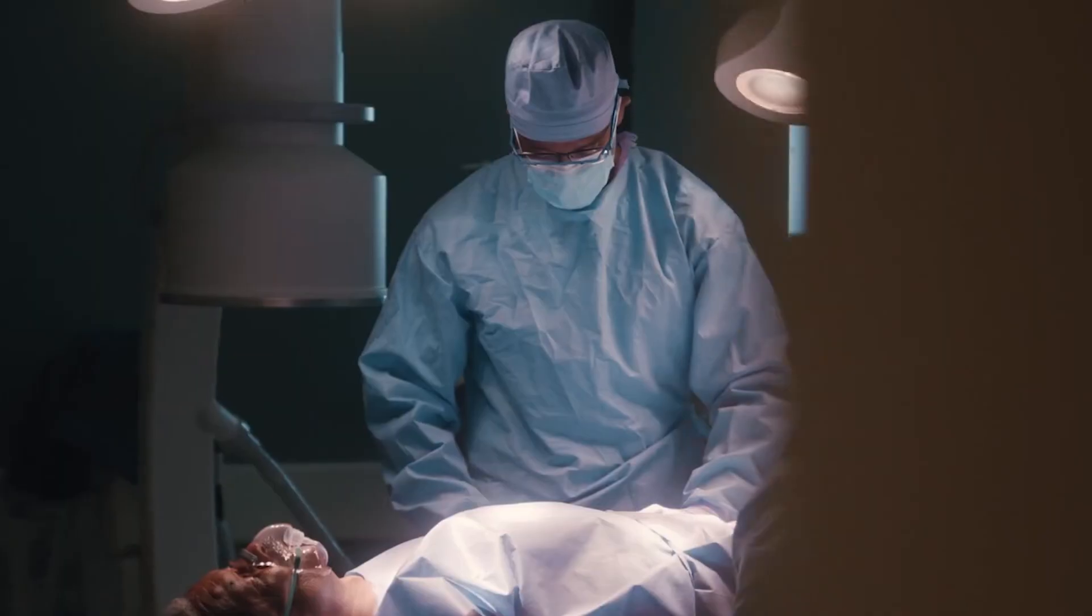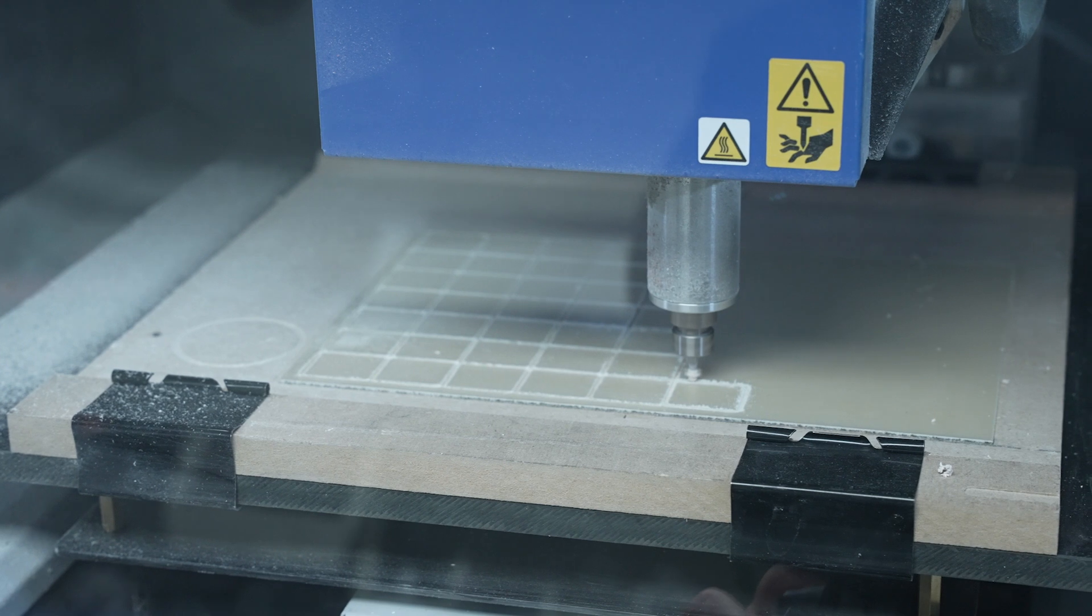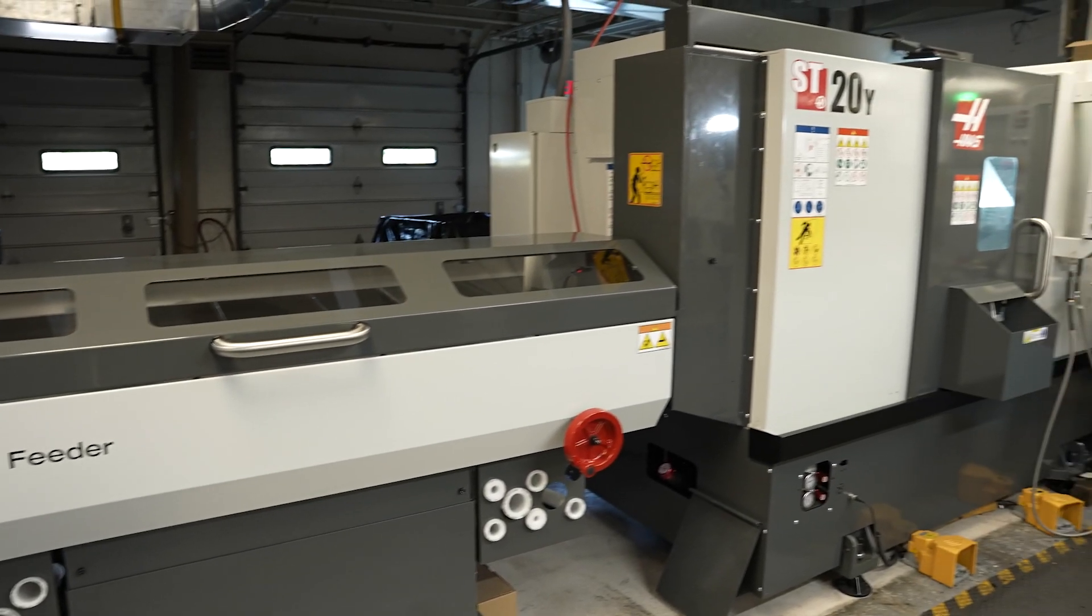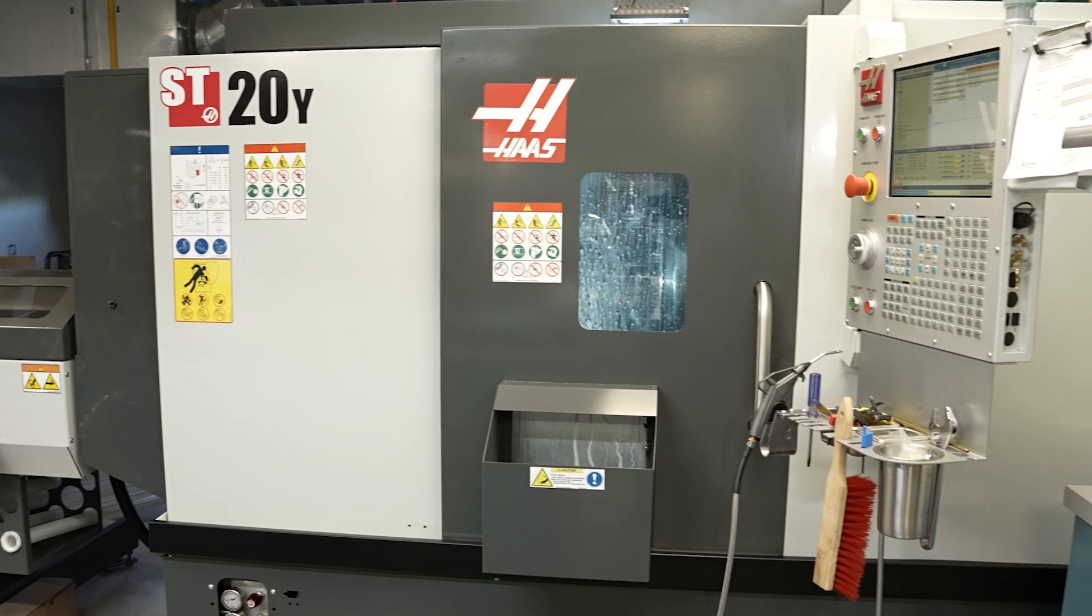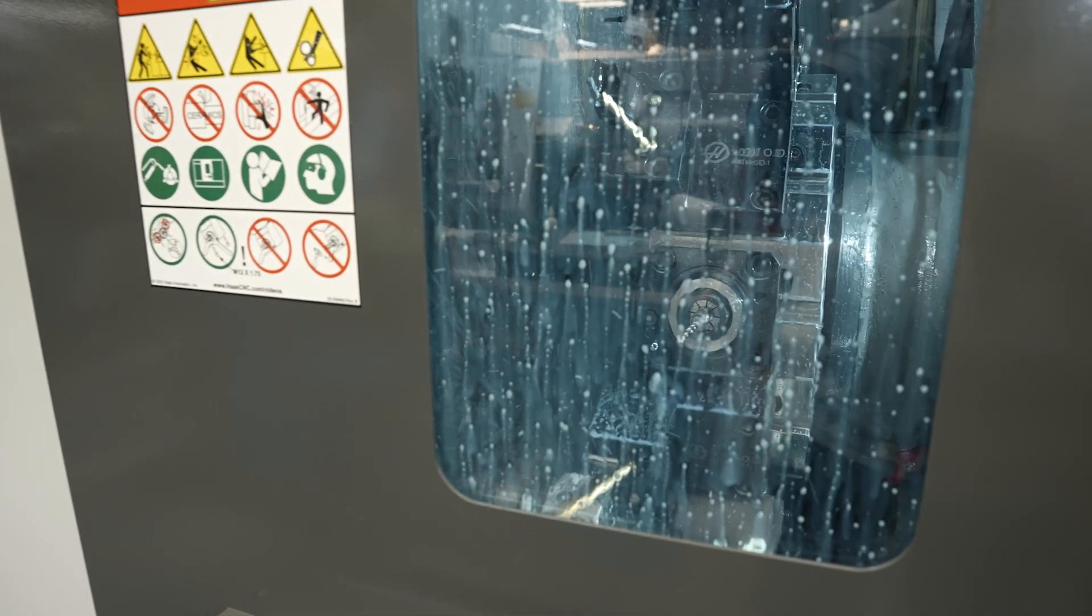Blaytech serves a diverse range of industries including medical, industrial, research, and the piezo composite sector. Our state-of-the-art machine shop, materials processing capabilities, and advanced assembly techniques ensure that every product meets the highest standards of quality and reliability.